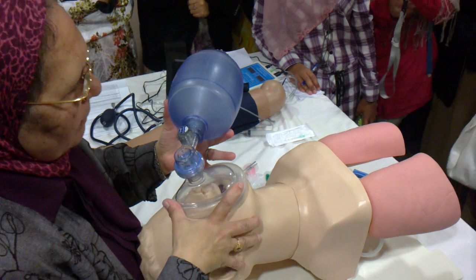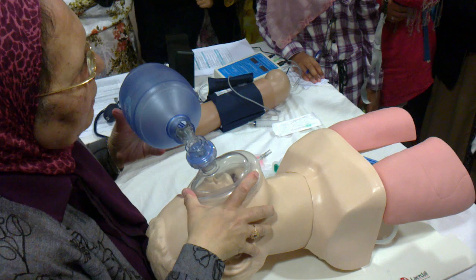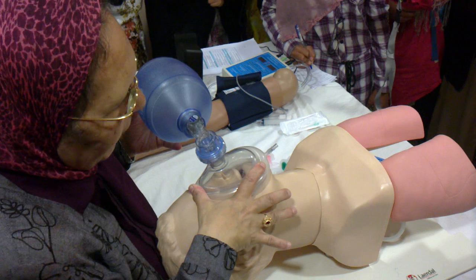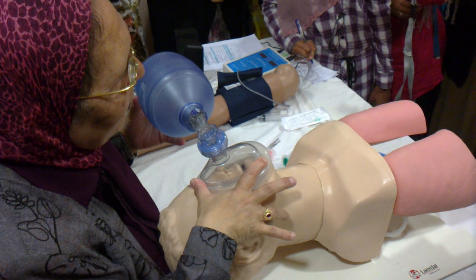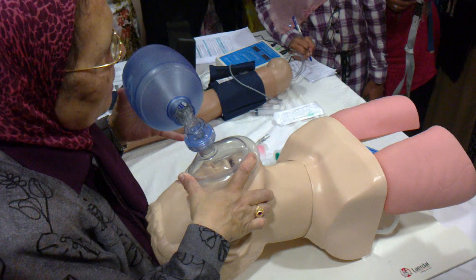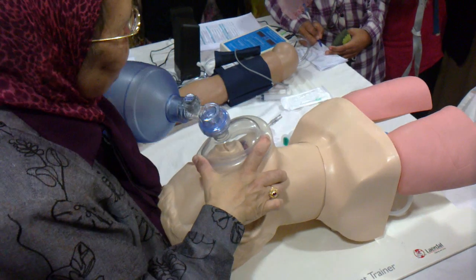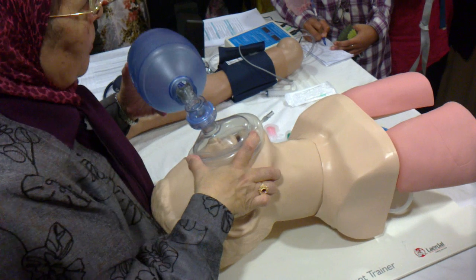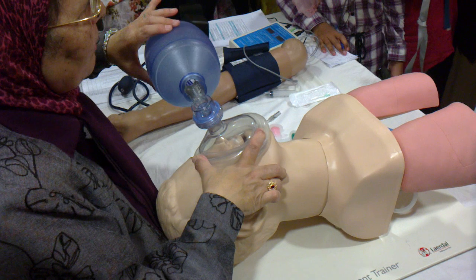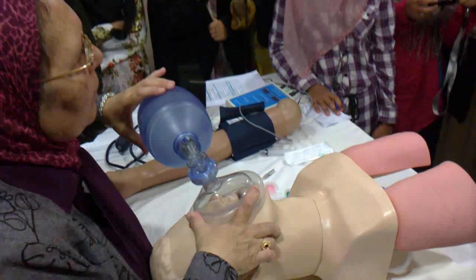like this, okay, with the dominant hand, the thumb at the nose, at the nasal part of it, the index finger here, and the middle and ring finger, you elevate the jaw doing jaw thrust. So you are doing C and E, okay, C and E. Fix it like this without speaking and ventilate. Compression, let it fill again, relaxation, at a rate of 10 compressions per minute.